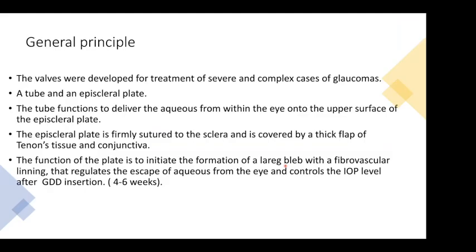So what happened recently? A few years ago, I started to feel a desperate need for the valves, as I'm facing cases which are suitable for valve implantation. And also I have seen that, yes, cycloablative procedures are quite good, but you might need a lot of repeats, and then a lot of debate in case you have an eye with very good visual acuity. So I felt a need for improving my abilities in the valve procedure.